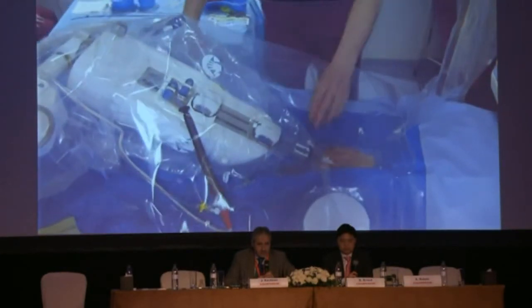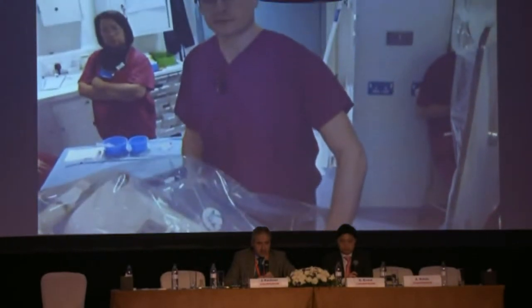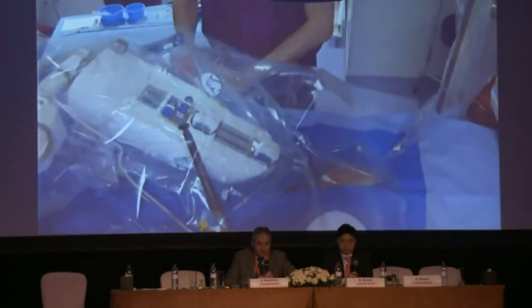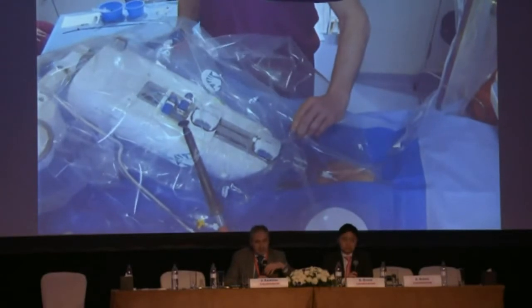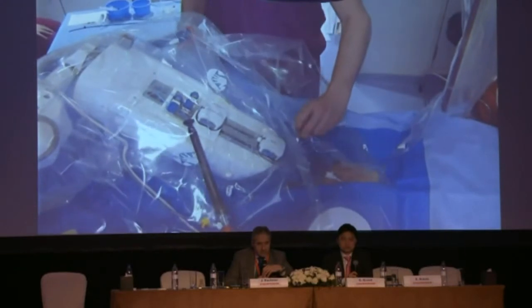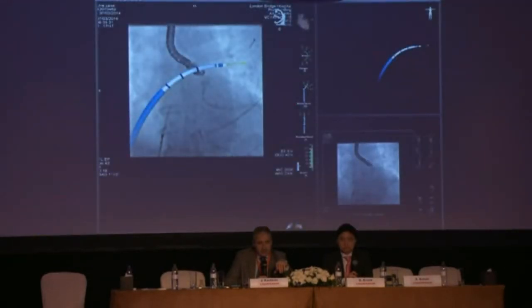And so I can just use the catheter to guide me across to the right veins, and I'm going to pop it into the right upper. Can I have a right lateral on the catheter, please? Neil, right lateral on the catheter, because I'm trying to get into the right pulmonary veins, please. Just going to get the sheath in to support me a little bit more. Have an AP, please, Neil.